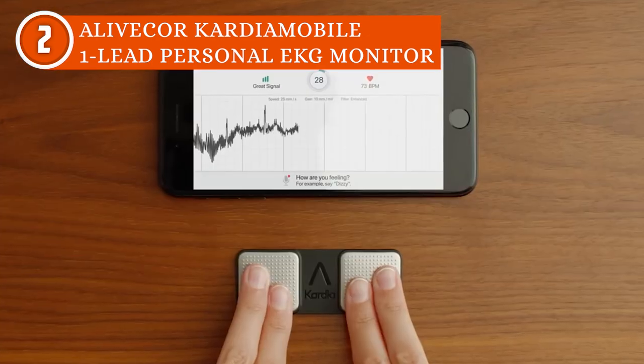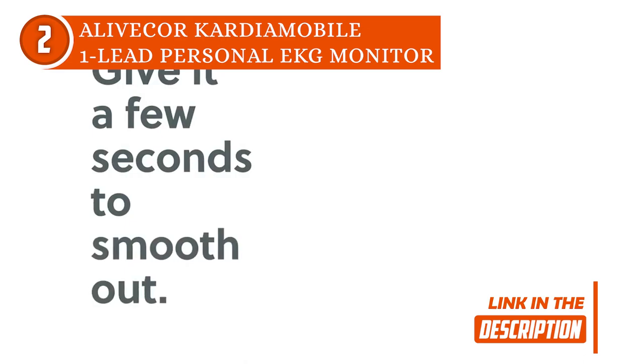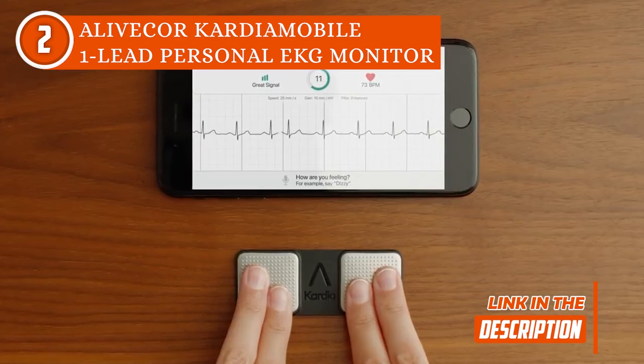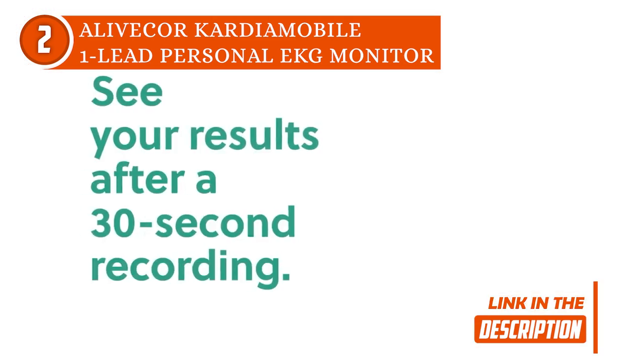Next, the app will ask you to sign up by providing basic information such as your name, height, gender, and email address. Then after a brief setup process, which more or less takes about 3 minutes, the device is ready to assess your heart health.